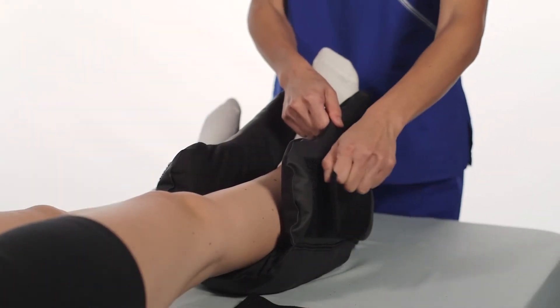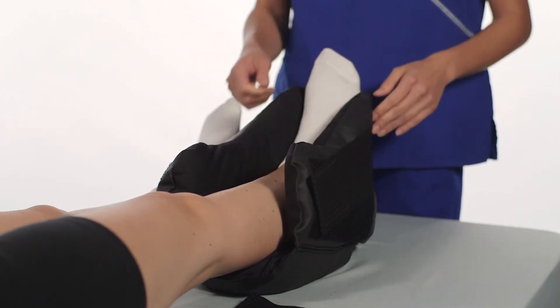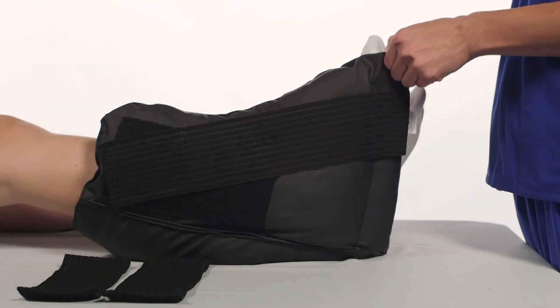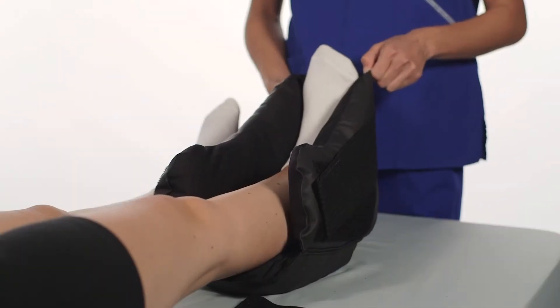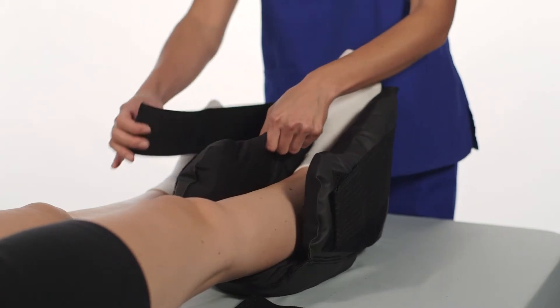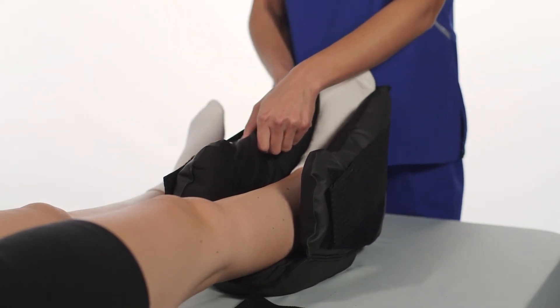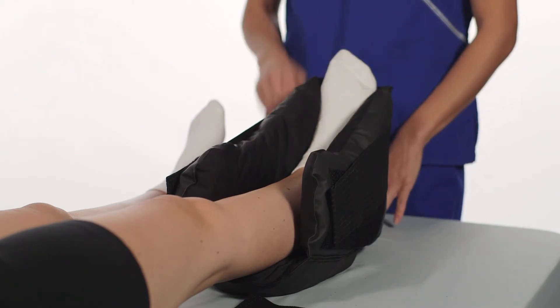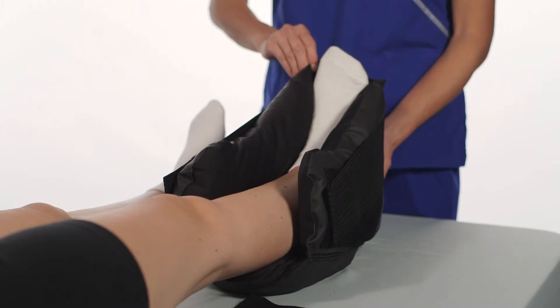Take one strap along the lateral side of the boot and secure the hook tab to the same side. Adjust the foot flap to ensure that the foot is comfortably placed inside the boot. Take the other strap along its lateral side of the boot and secure the hook tab to its side. Adjust the foot flap again to ensure that the foot is comfortably placed inside the boot.